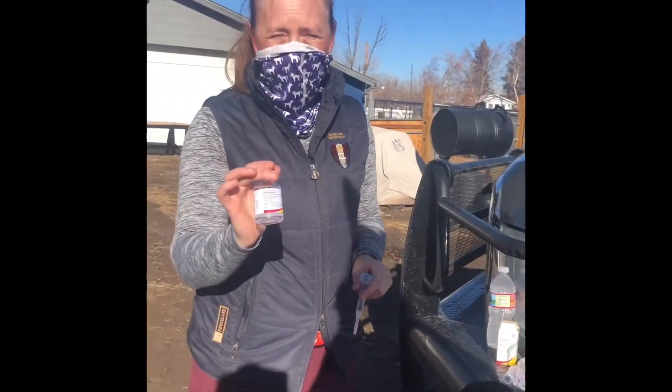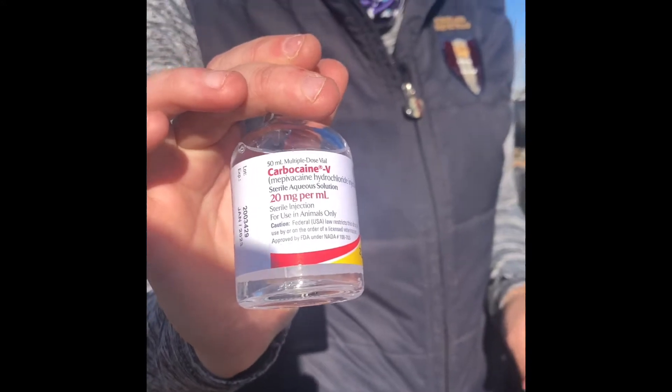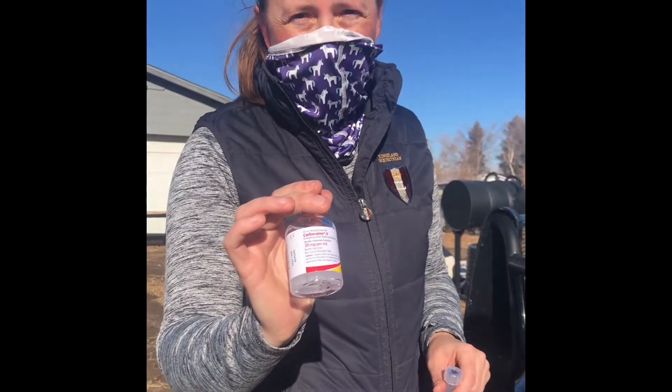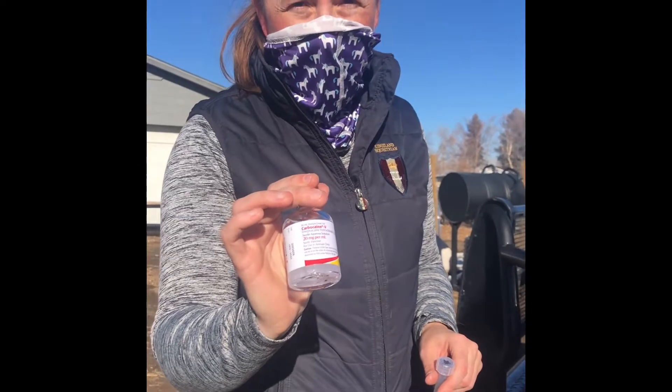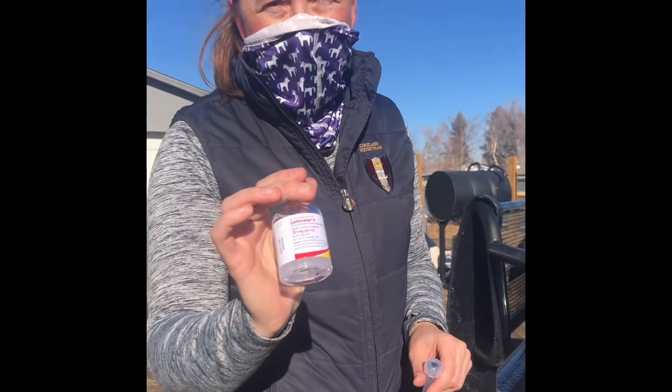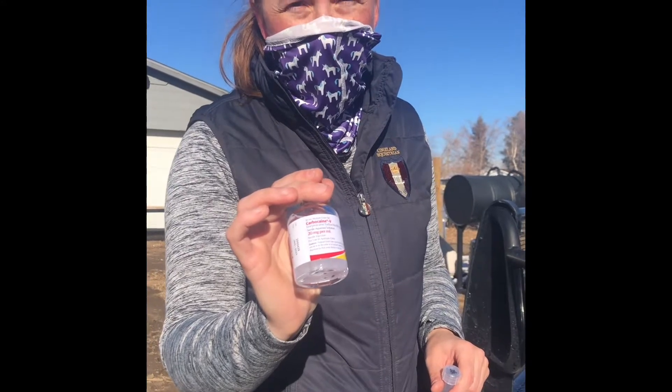So we've got some carbocaine here. This is a local anesthetic which I'm gonna inject under the skin right over the areas where the nerves pass. This is gonna dull the sensation in the nerves in certain parts of her foot or leg and may help tell us what's hurting her and causing her to be lame.